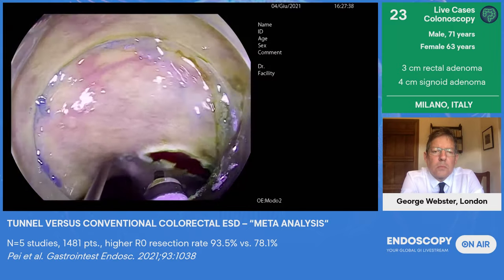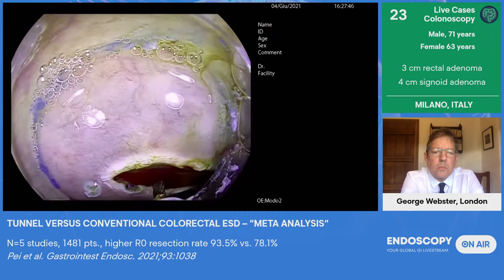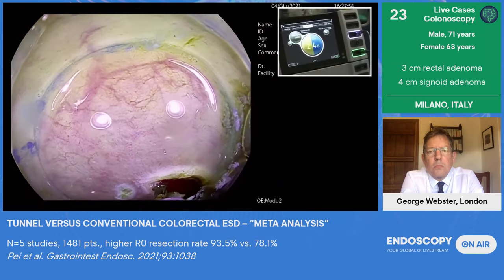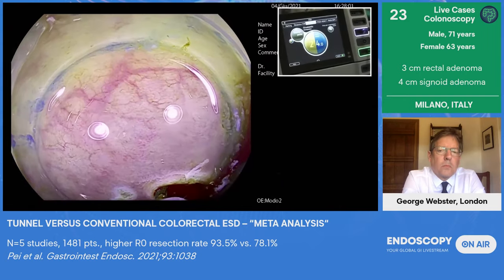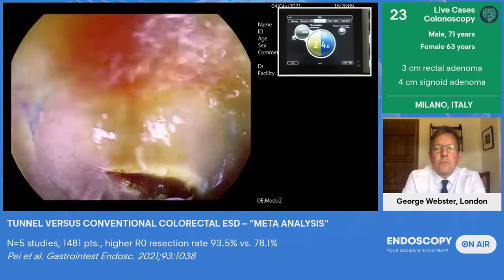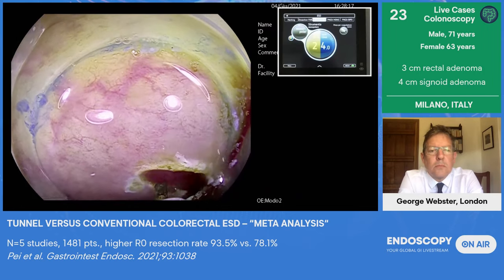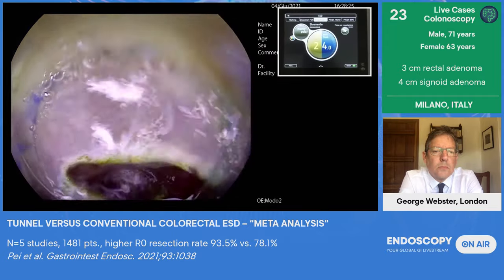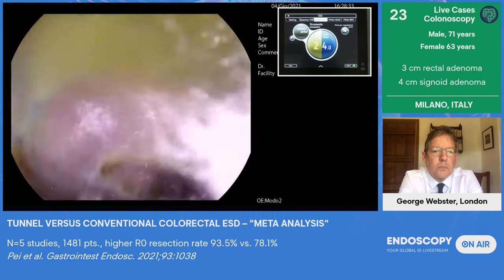Let me check for bleeding. We are in the rectum, so you know that the vessels are more present here. Here we are. So with the blue. It's a small bleeding, but I want to coagulate it. Otherwise, all the plane will be dirty and it will be difficult to understand which one is my right plane. Here we are, the vessel is here. So with the same tip, with a different current, I'm trying to coagulate.